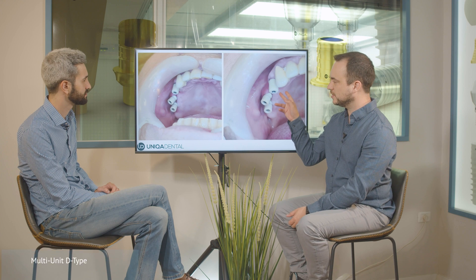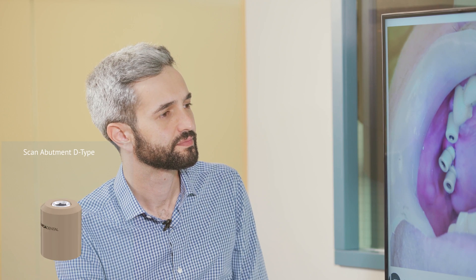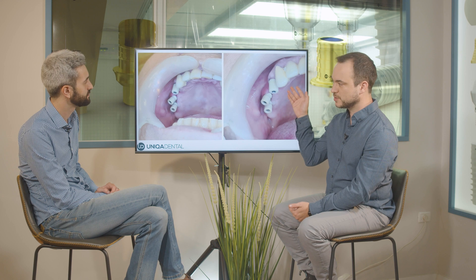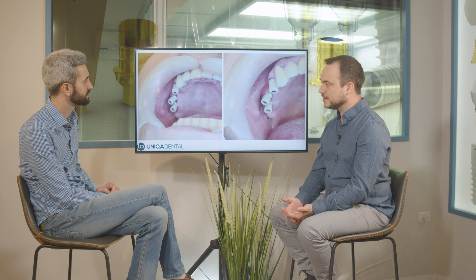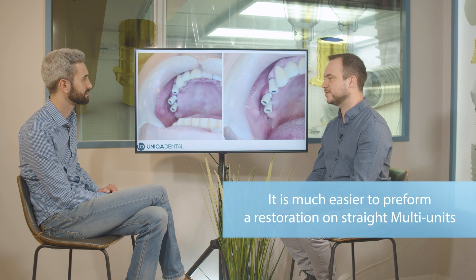And this is the D-type multi-unit. Beneath this scan abutment it can be either an angulated multi-unit or a straight one. In this case, we probably have an angulated multi-unit because the angulation of the bone is going toward the buccal part. This is an anterior tooth — tooth number 14 — so you'll have the screw channel in the buccal part of the crown, which is something you don't want because of aesthetics. Those two multi-units are more posterior, so you don't see the screw channel and it's much simpler to have a restoration on straight multi-units.